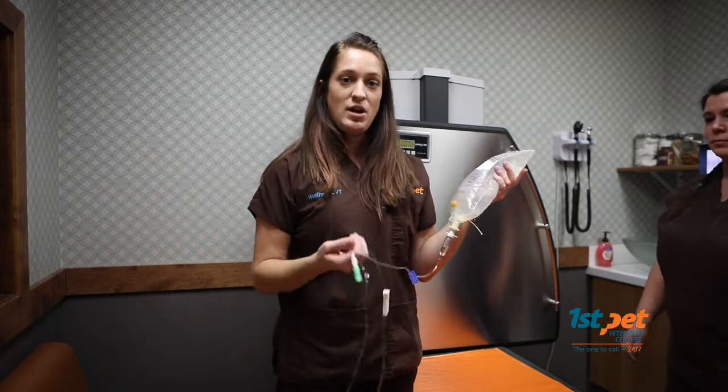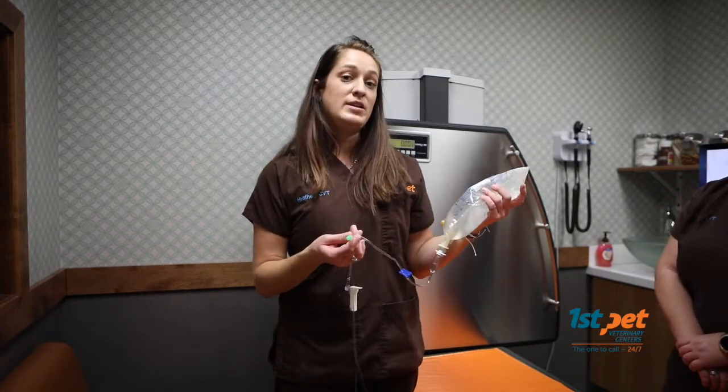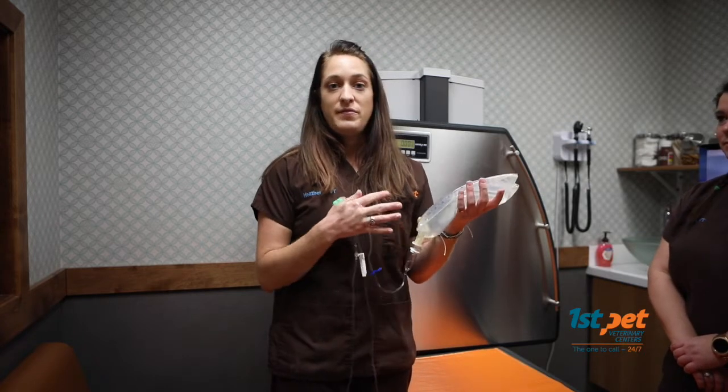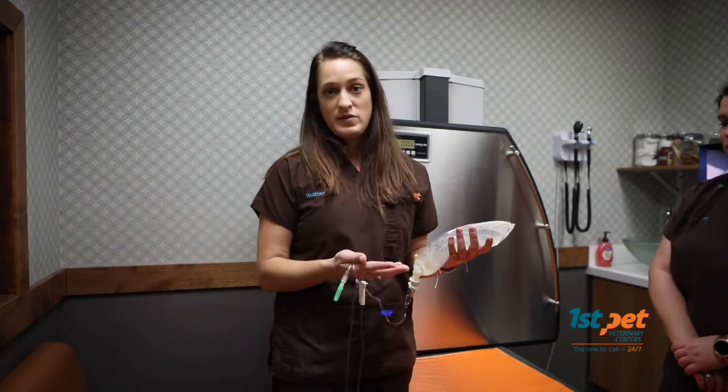For storage of your sub-Q fluids, they do not need to be refrigerated, they do not need to be warm, they just need to be room temperature. It's not light sensitive, and if you need to keep them on your counter or in a cupboard, any of those areas are just fine.